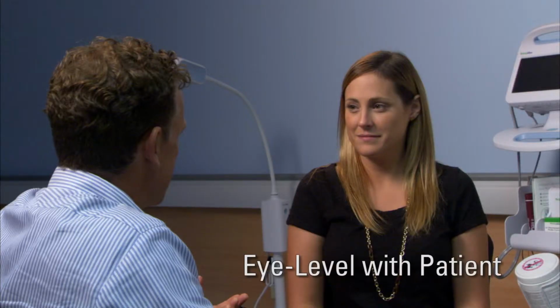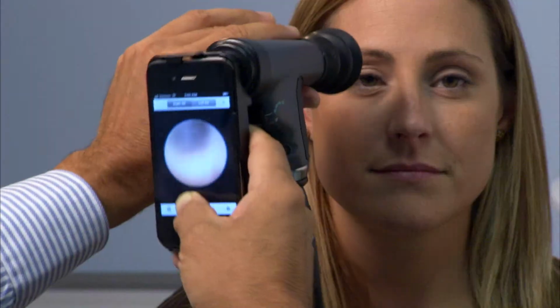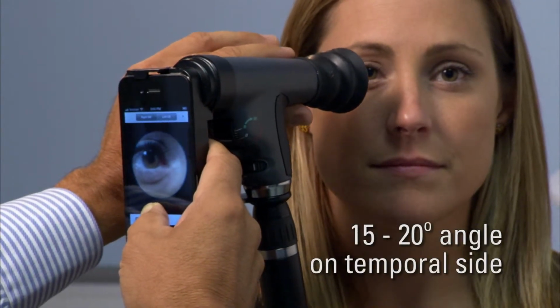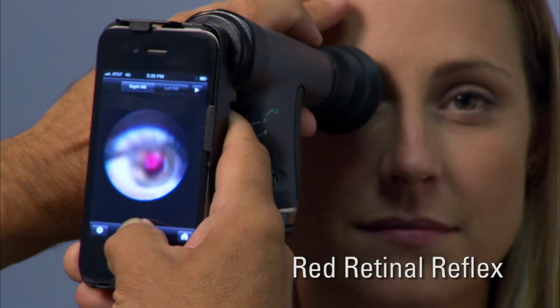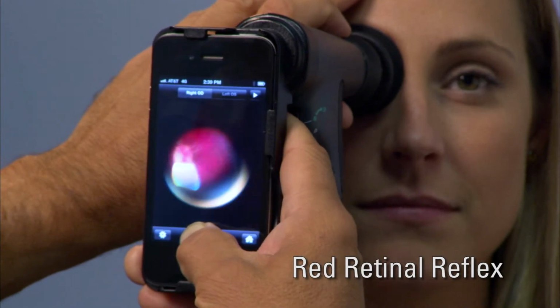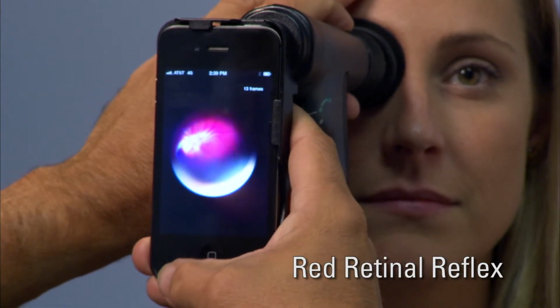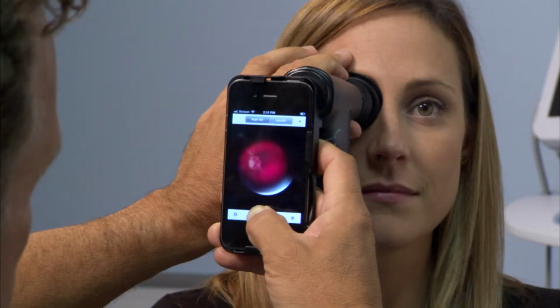Position yourself at eye level with the patient and instruct the patient to look over your shoulder at something on the back wall. Direct the illumination into the patient's eye at a 15 to 20 degree angle on the temporal side. Find the patient's red retinal reflex on the screen. Once you see the red reflex, move slowly closer to the patient, keeping the reflex in the very center of the screen. If you find it hard to stay steady, you can rest your fingers on the patient's forehead.